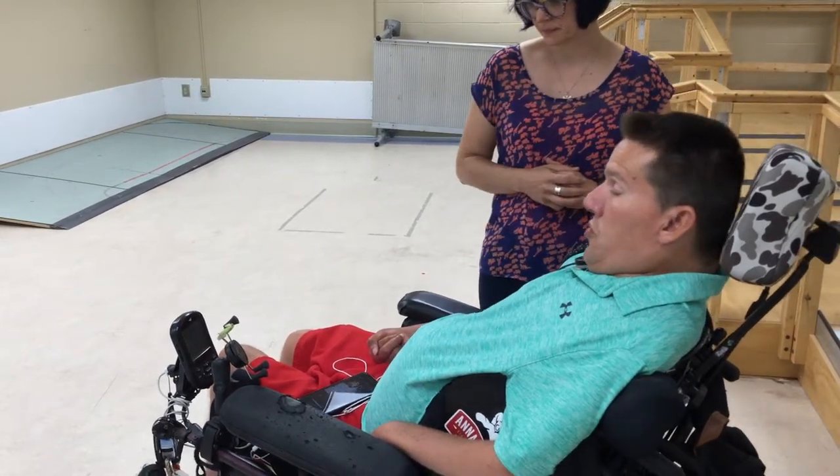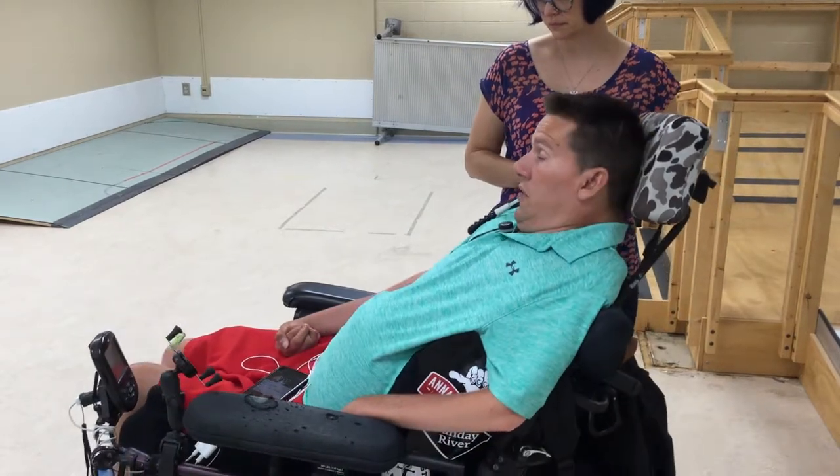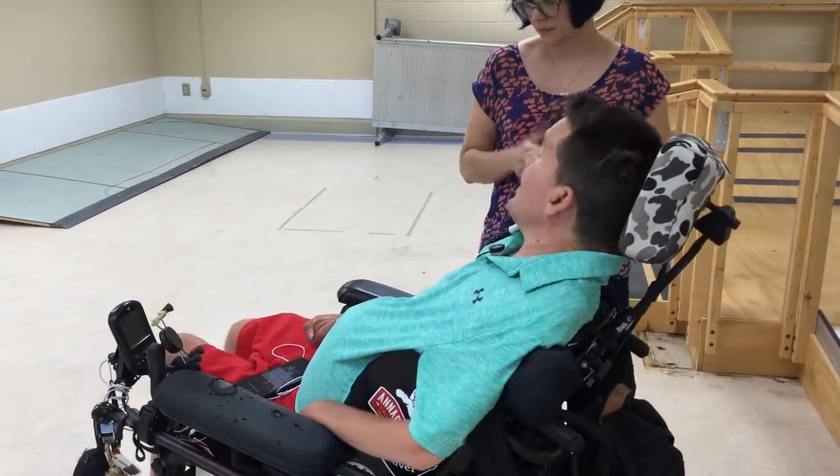I can move my head forward to go forward. The further I move my head forward, the faster I go. And back, right to left to right. Excellent.